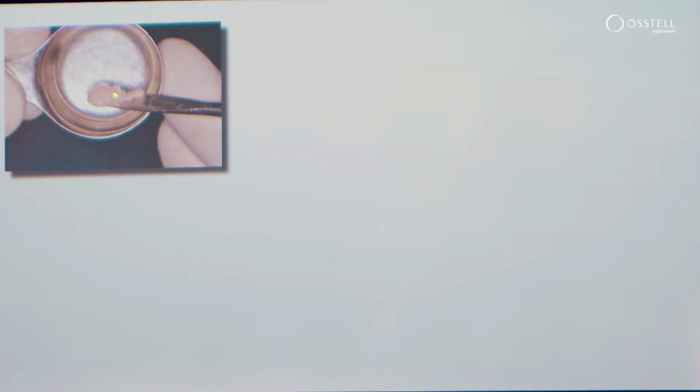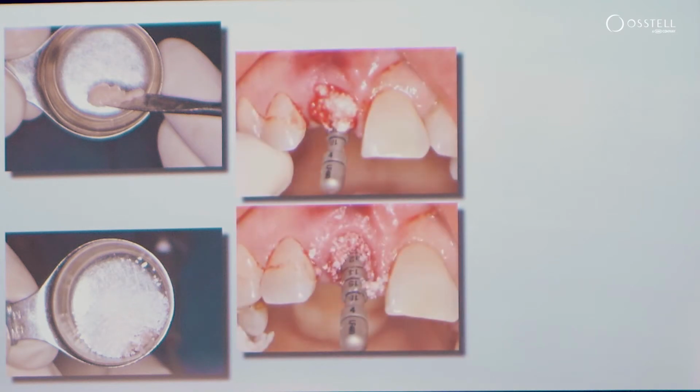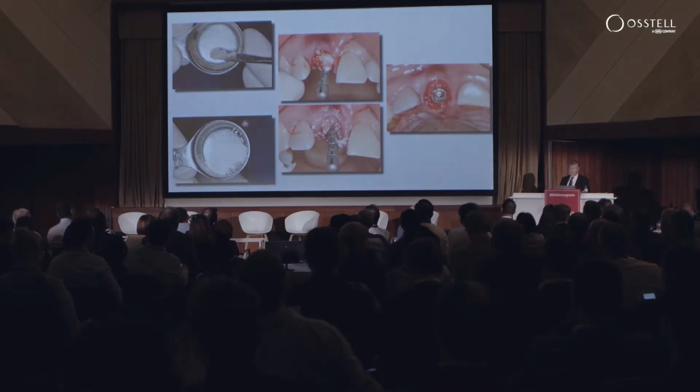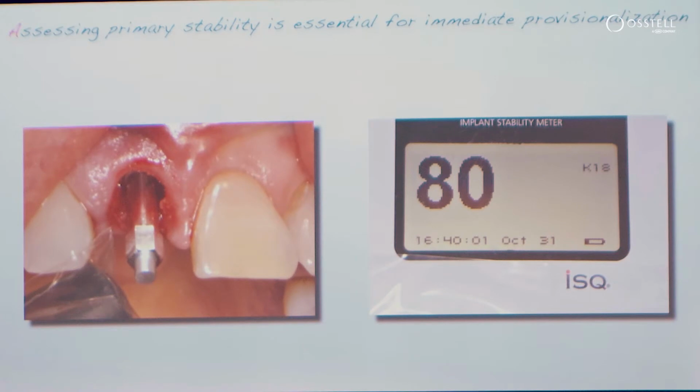That same combination of autogenous bone chips plus demineralized bovine bone, which is slowly resorbing. I like to pack the socket with a guide pin in place in order to make sure we get a good fill, but not over condense it. Implant is placed to the palatal. And then the key is we need to have good primary stability. Even though there's a lot of facial graft material in contact with this implant, it still has excellent primary stability.